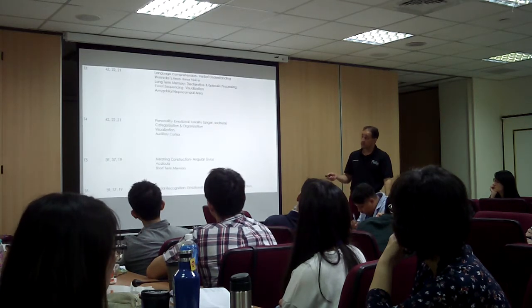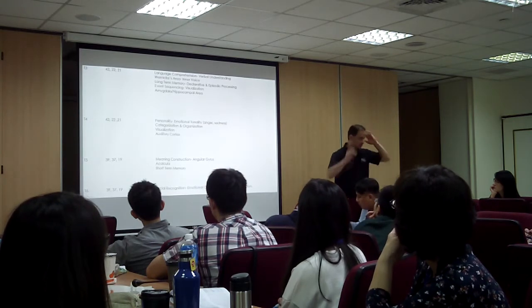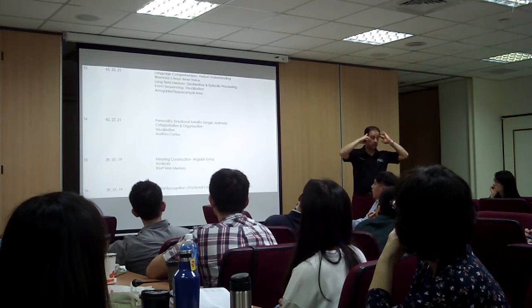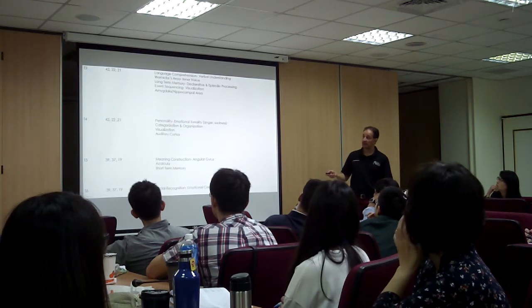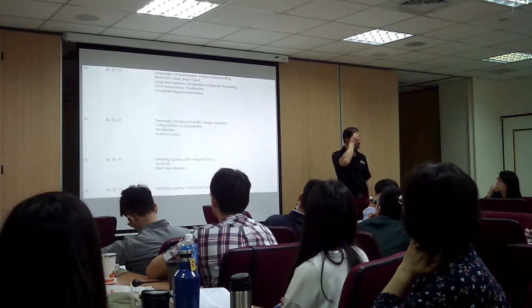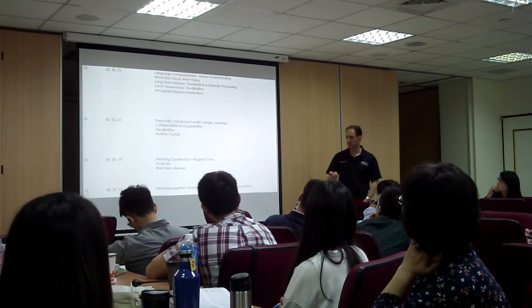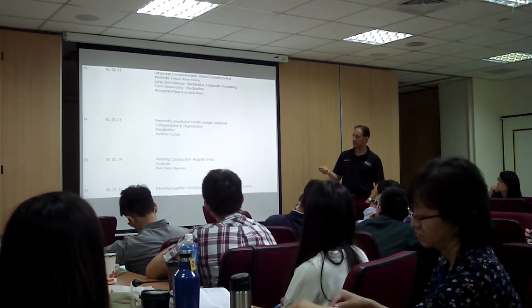Now T3 and T4 for rage issues, anger management. T3 and T4 is very good. Normally you don't want to see alpha in the temporal lobes. If you have a lot of alpha in the temporal lobes, you have to suspect there's something going on there, and you downtrain.